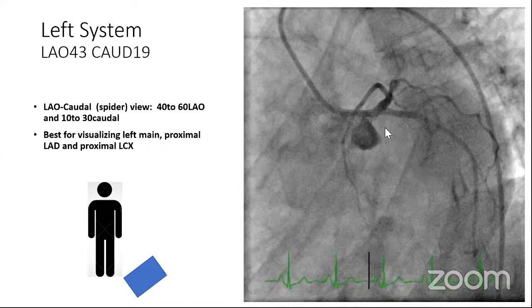So this is great for visualizing the left main, the proximal LAD and the proximal LCX. You can actually see the whole LCX in here without any lesion.